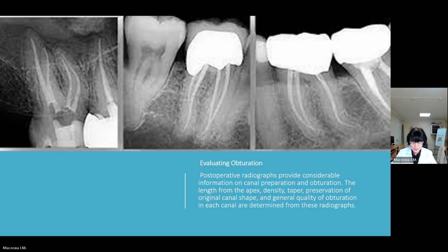The next complication is a missed root canal. Canal anatomy can be complex and variable. Clinicians can sometimes miss a canal in a complex tooth structure. The increasing use of more advanced 3D radiographic images, CBCT, is very helpful to reduce these errors.